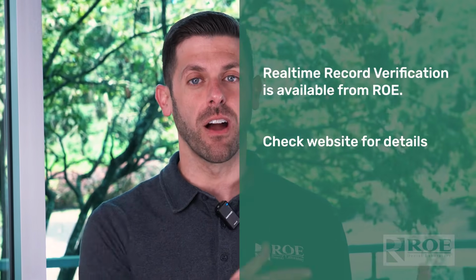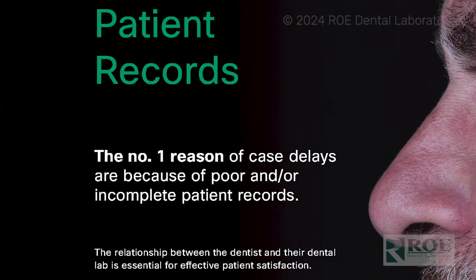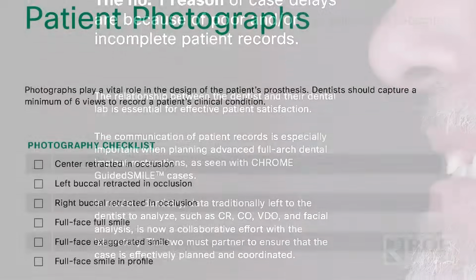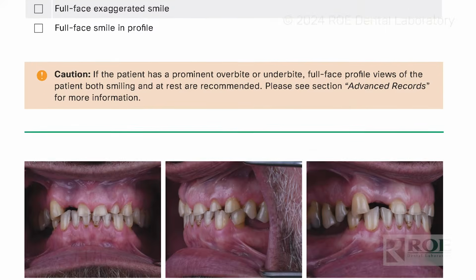Well, we want you to submit the records like you always do, and we ask now if you could just verify that the records are perfect. Because once the records are here and the patient's gone and we review it, if something's off, you have to have the patient come back. So, please give us a call. You submit the records. If there's any questions on those records submitted, call us. We'll verify them while the patient's here and then send them on their way. And we're going to immediately start plating this case.